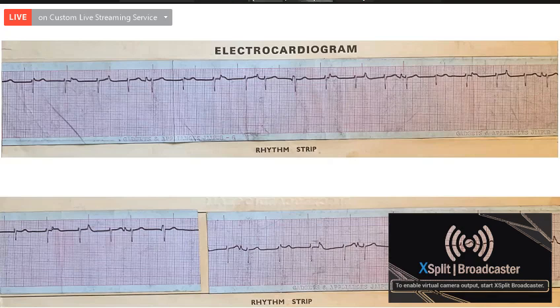Sir, a junctional ectopic activity. No, junctional rhythm. It is a junctional rhythm with intermittent, what is this atrial beat? Yes, sir, atrial capture. It's not an atrial capture, it's a sinus capture. There's a basic junctional rhythm with a sinus capture.